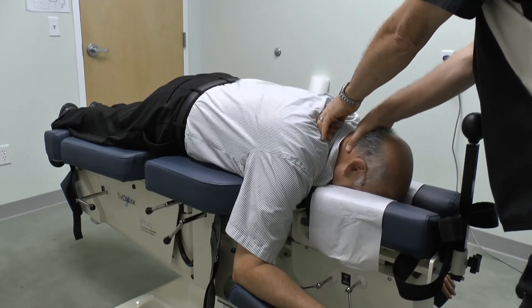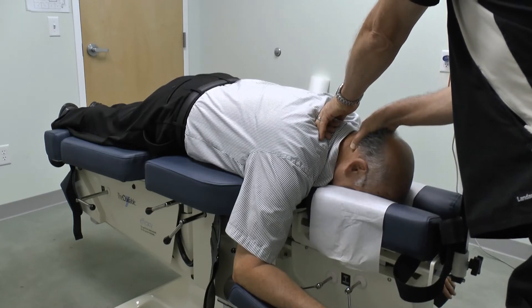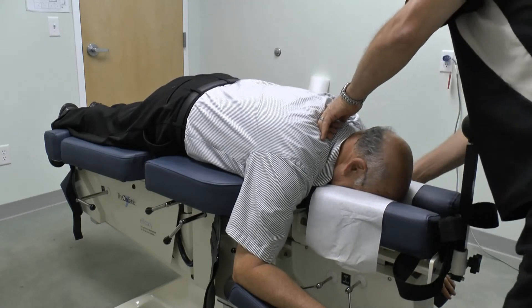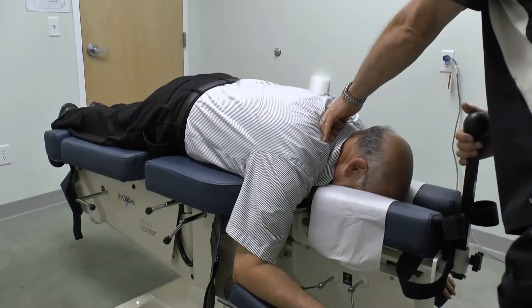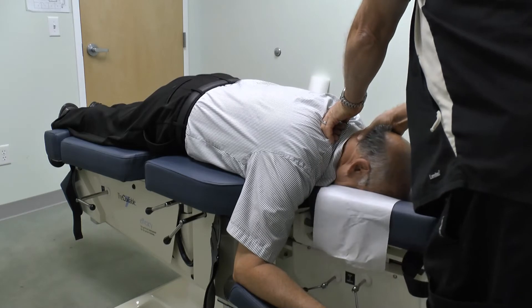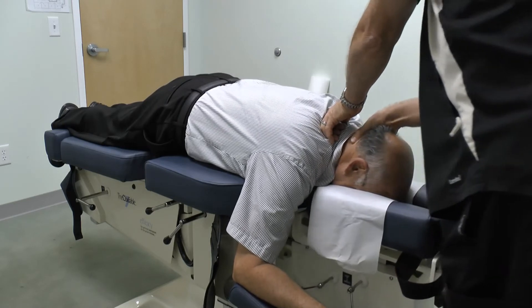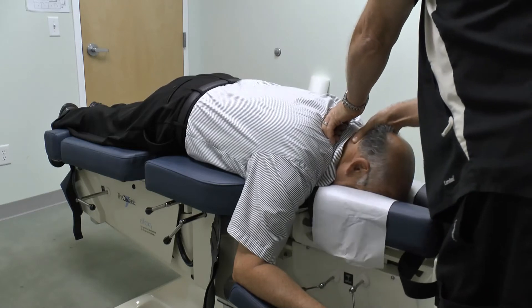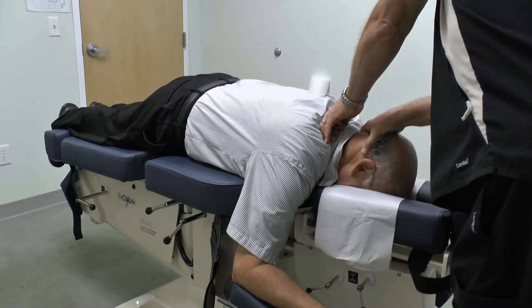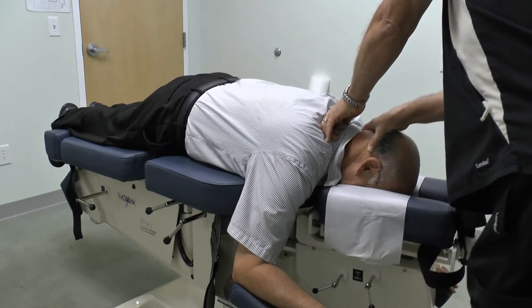Are you okay with that? Mm-hmm. Next we will do lateral flexion under long y-axis.